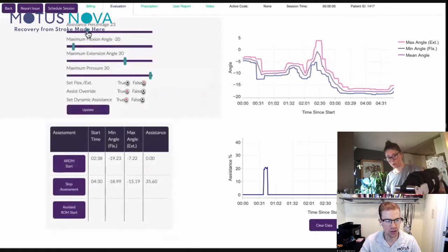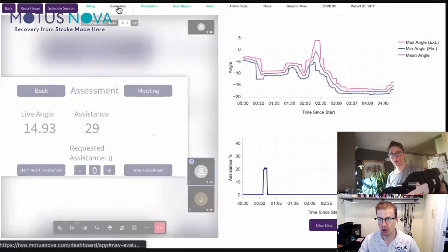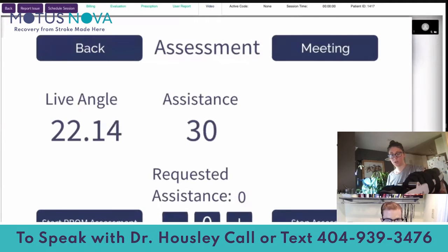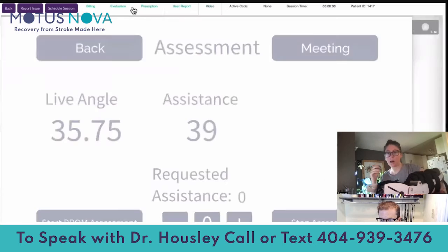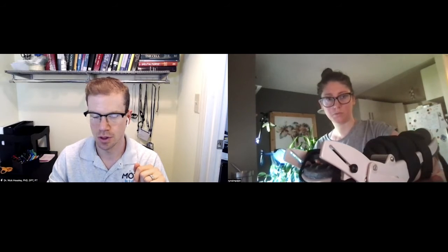Now let me know as soon as you feel a kind of a stretch. We're just going to be walking through kind of a passive range that a therapist would do in person. This is just going to help me figure out where your upper limits of movement are. So let me know if at any point it becomes kind of a strong stretch or uncomfortable. It shouldn't be painful, but we want to see. Not at all uncomfortable. Very good. Okay. Perfect. We'll keep going up here.